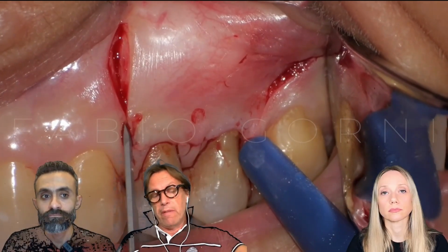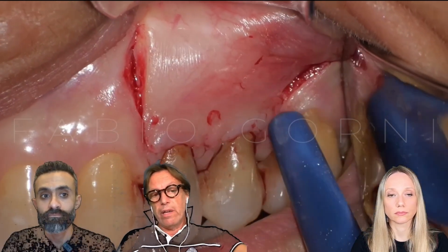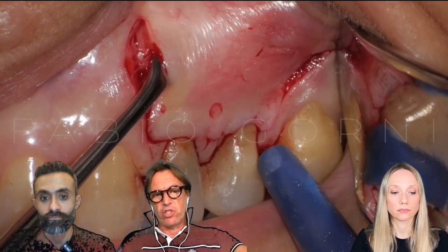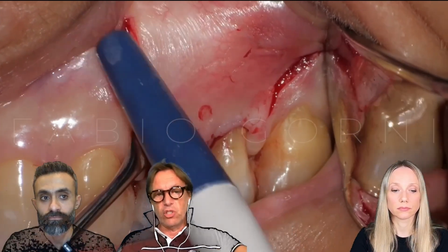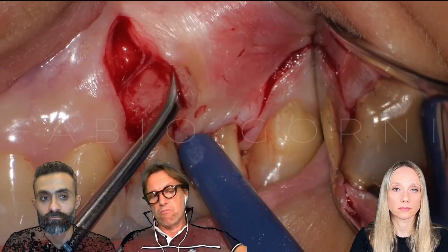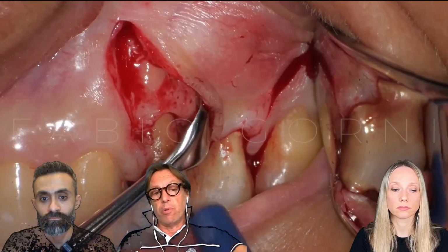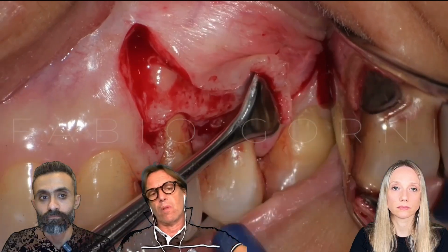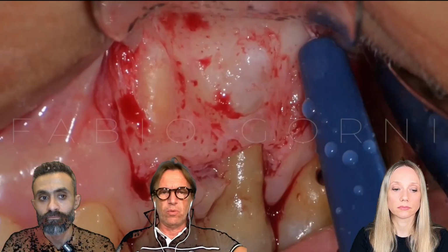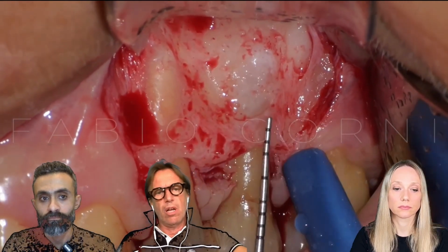And the flap should be wide enough to facilitate the reflection, to facilitate the vision and the access. And of course, also the repositioning of the flap carefully, because the stitches and the healing of the flap and the soft tissue depend on the precision of the stitches and the precision of the incision.